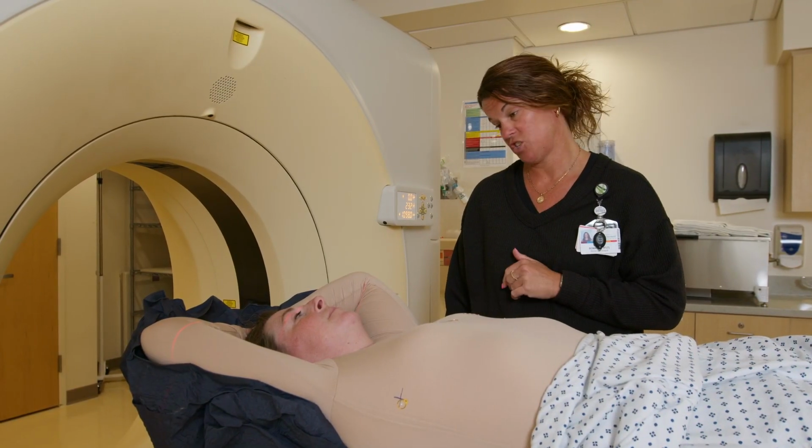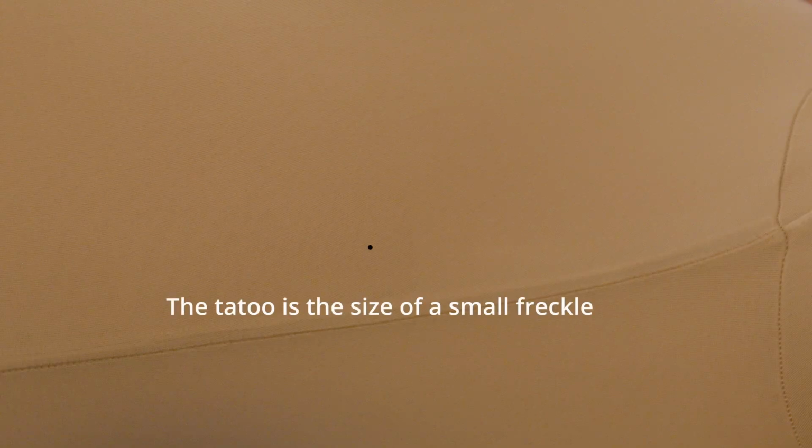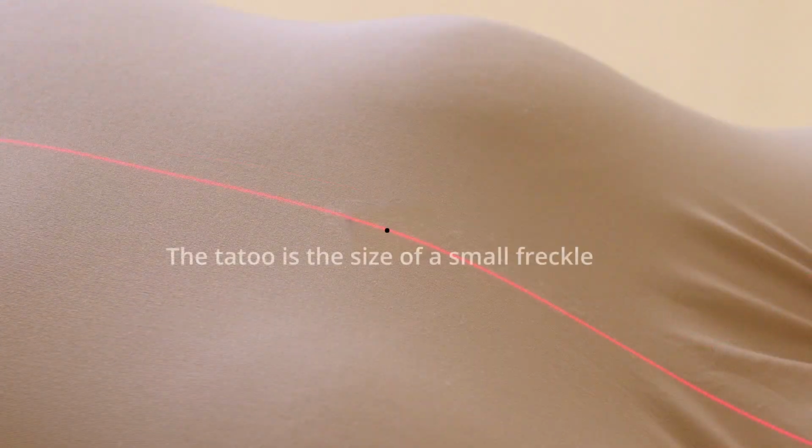Once the CT scan is completed, the therapist will finish the simulation procedure and give you a few tattoos the size of small freckles. These are placed with a thin needle just below the skin surface. These are necessary for your treatment, as the therapist will use them to get you into the same position each day.